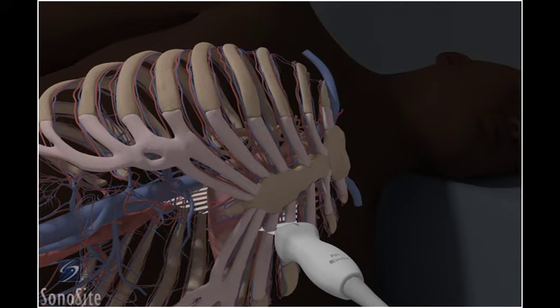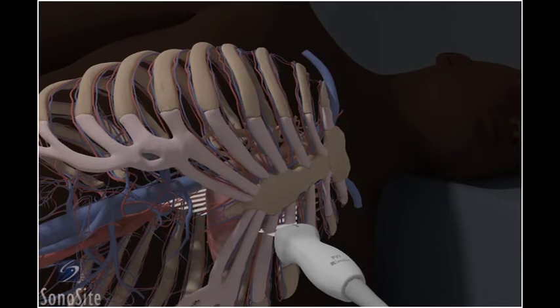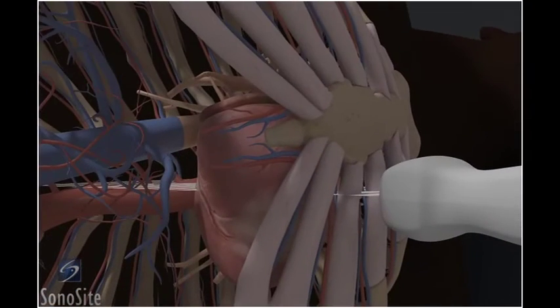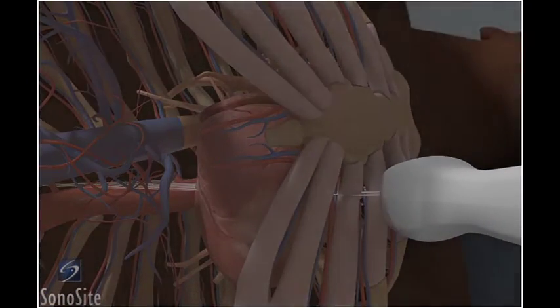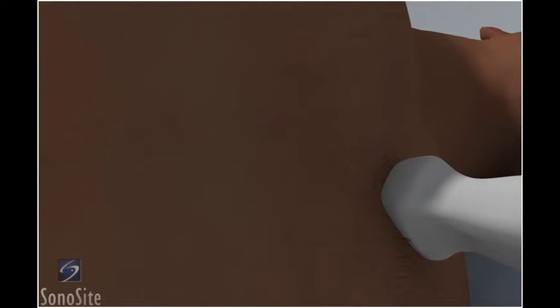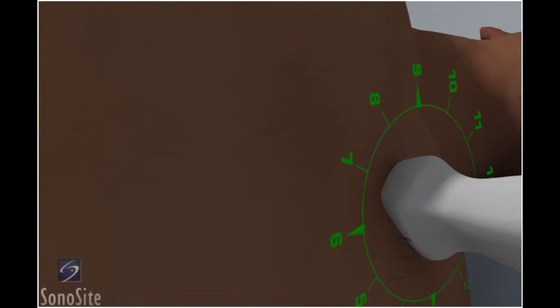Assuming the short axis of the heart to be positioned on a plane from the patient's right shoulder to the left hip, rotate the transducer to adjust for the body habitus of the patient. The orientation marker will be at approximately the 2 o'clock position.